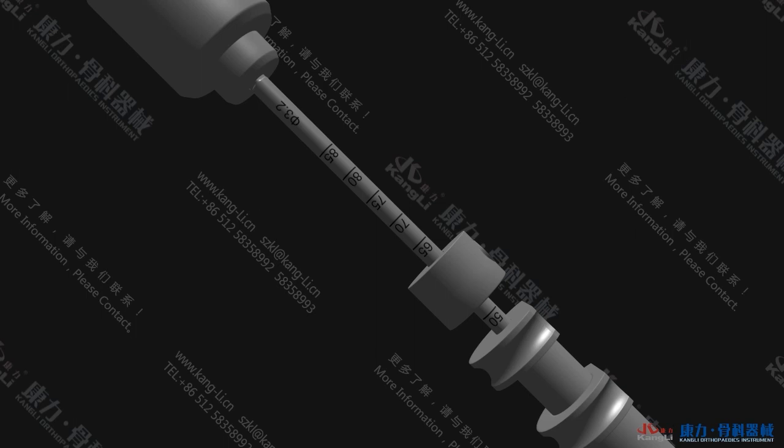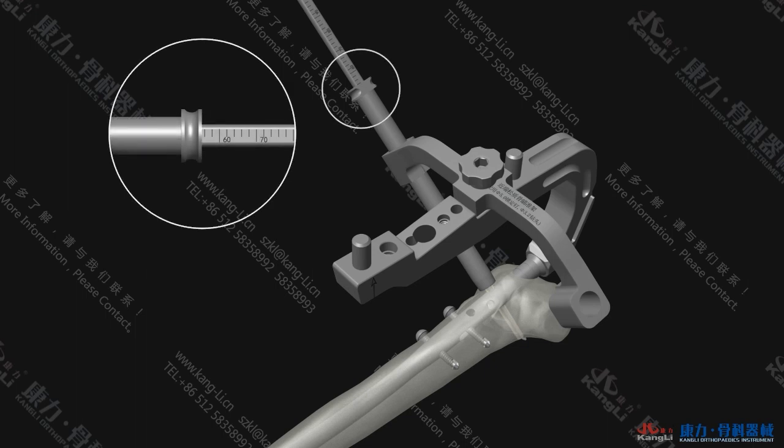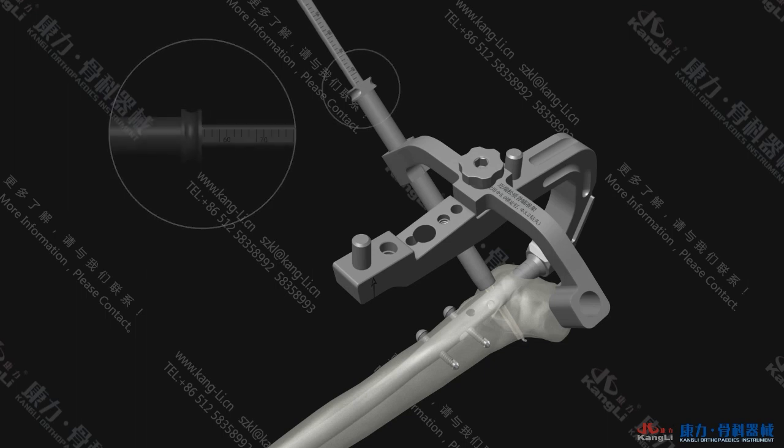inner sleeve to about 0.5 cm using an SL wrench to protect the soft tissue of the contralateral skin. Then continue drilling until the contralateral bone cortex is drilled through. Remove the Φ3.2 drill bit and the inner sleeve. Keep the outer sleeve closely contacted with the bone cortex and insert the guide depth gauge to measure the diameter of the bone. Choose the Φ5.0 locking screw with appropriate length and screw in with the 3.5 hexagonal screwdriver.